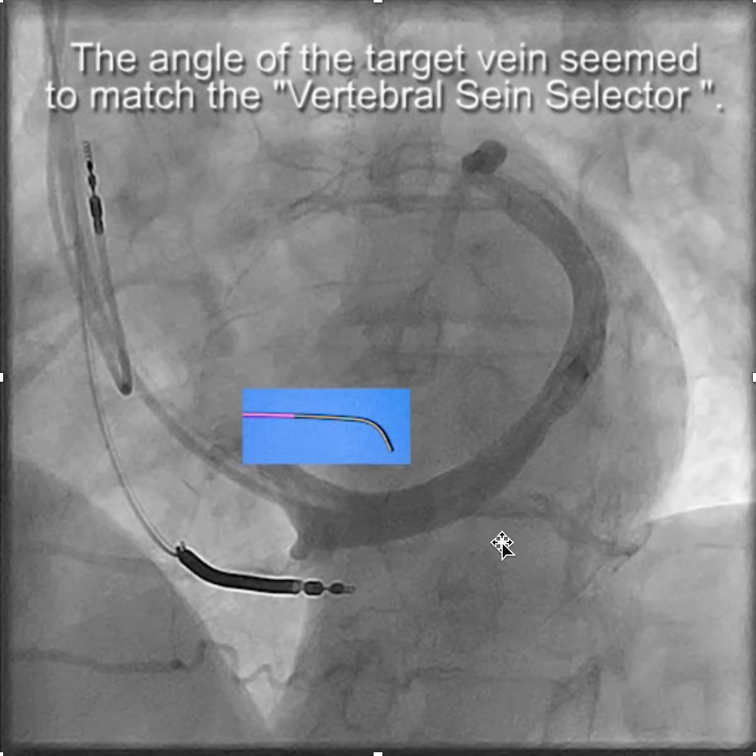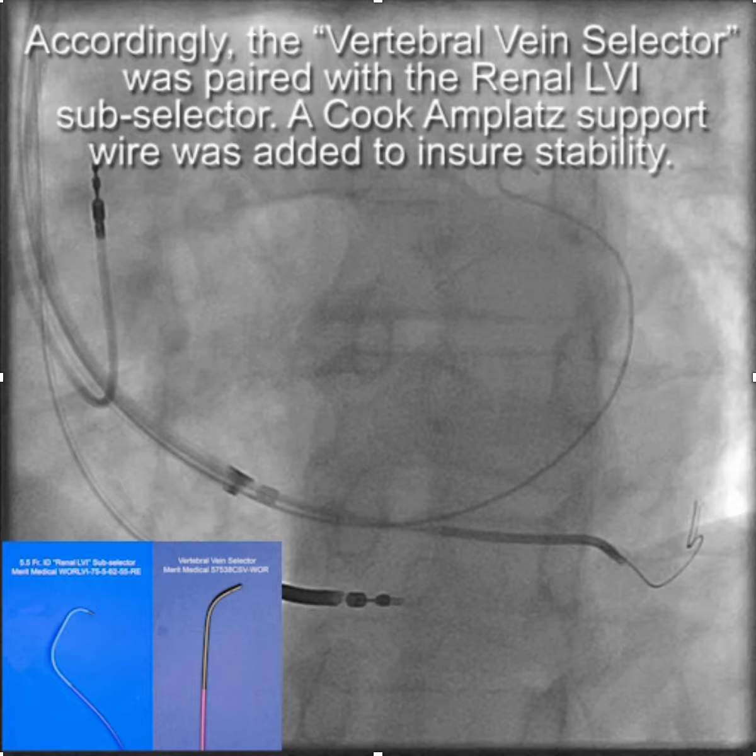You can see here that the branch that comes off near the OS of the CS has a rather flat angle, which matches nicely the vertebral-shape vein selector. So we paired the vertebral vein selector with the renal LVI.